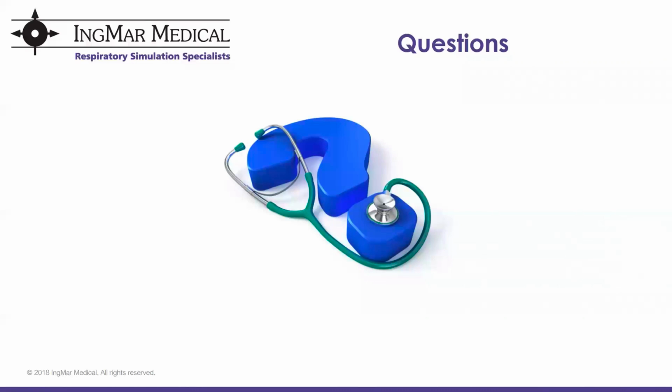And these were really lung models, as I would refer to them, that would again be combinations of resistance, compliance, and effort parameters used to create disease states such as ARDS or COPD or asthma. We have a library of about 36 of those patient conditions created that could be run simply by double-clicking them from our library. And you would be up and running very quickly with that breathing pattern that can be connected to interact with a ventilator.